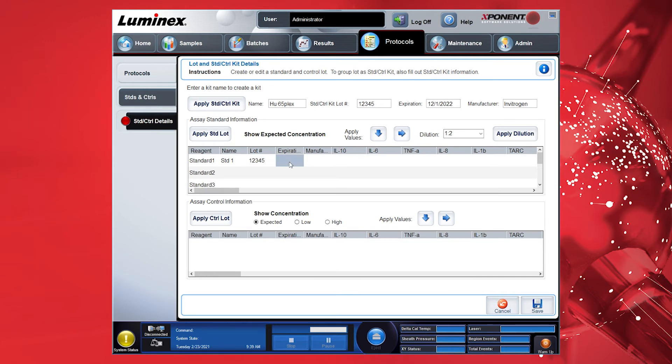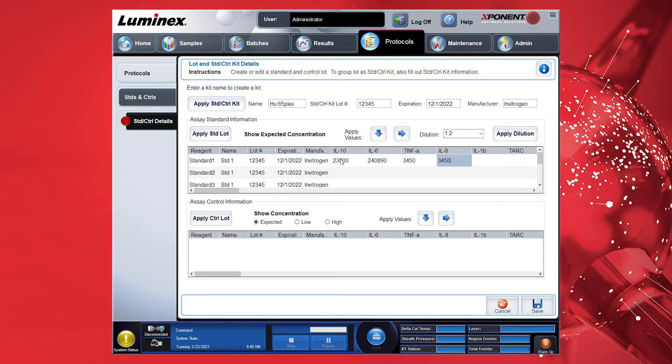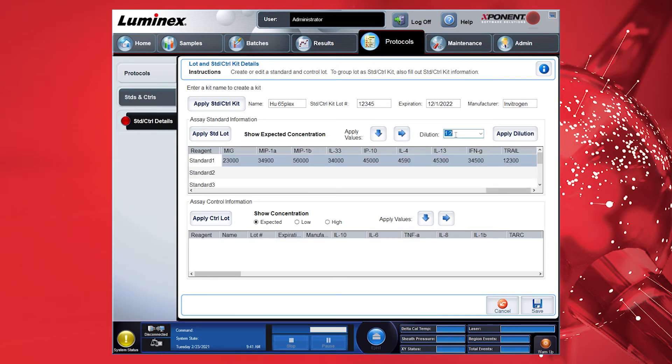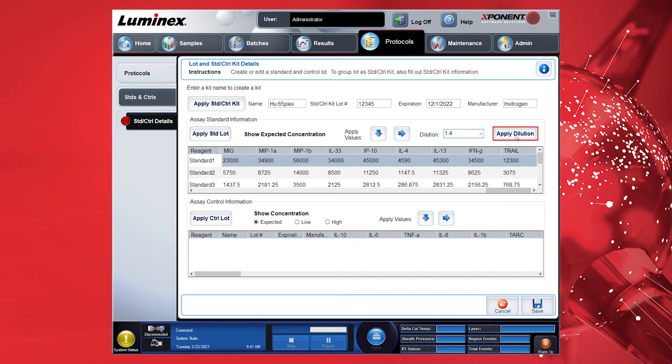When entering the expiration date, please use the American format with month, day, and year. Use Invitrogen as manufacturer. Then enter the S1 concentration for each target from the Certificate of Analysis. Enter the dilution factor for the standard curve. For ProCartoPlex immunoassays, it is usually 1-4. Now mark the first entire row and click Apply Dilution. All standard concentrations will be automatically calculated.